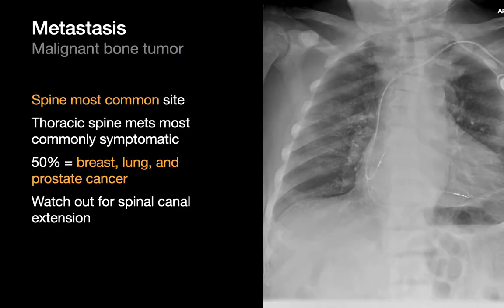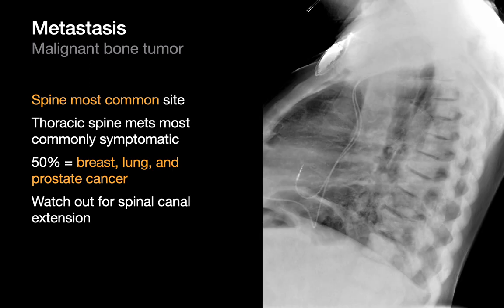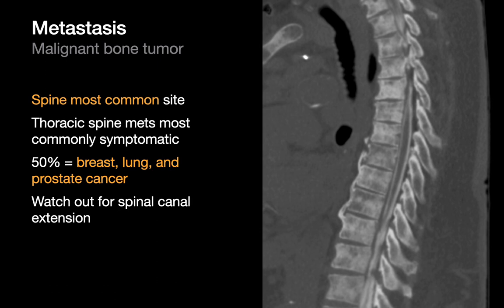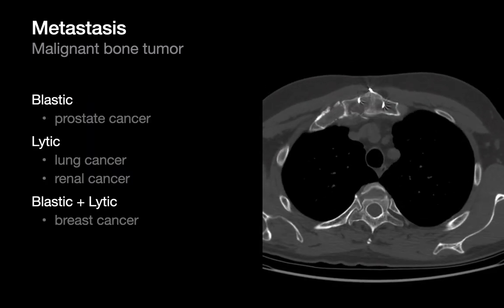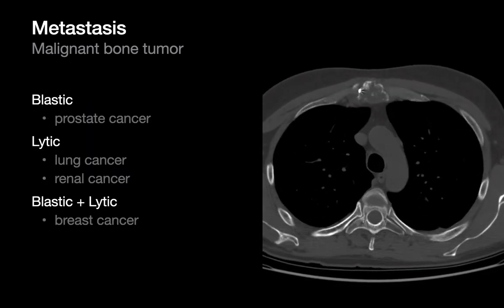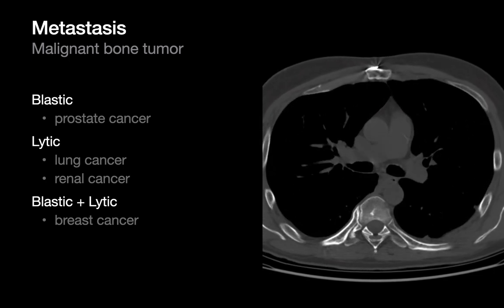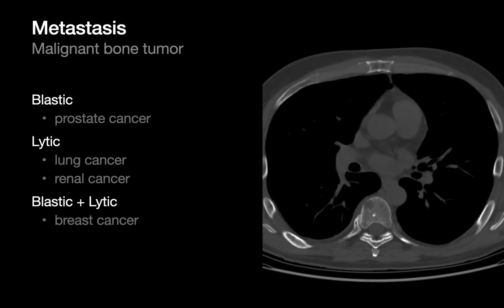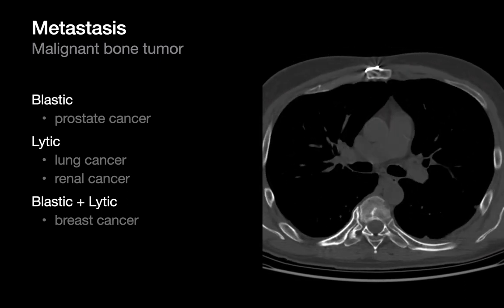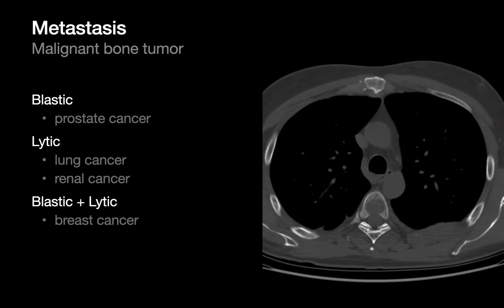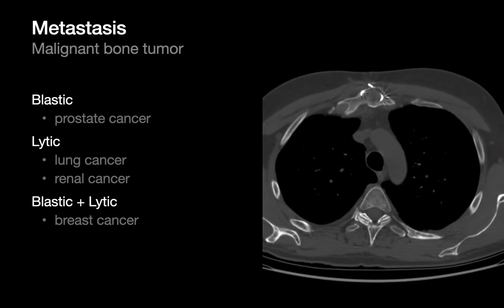Bone metastases in the chest will occur in the spine most frequently, and the top three causes are breast cancer, lung cancer, and prostate cancer. Bone mets can be blastic, lytic, or mixed. Prostate metastases tend to be blastic, while lung and renal mets tend to be lytic. When mixed blastic-lytic bone metastases are seen, breast cancer is the first consideration.